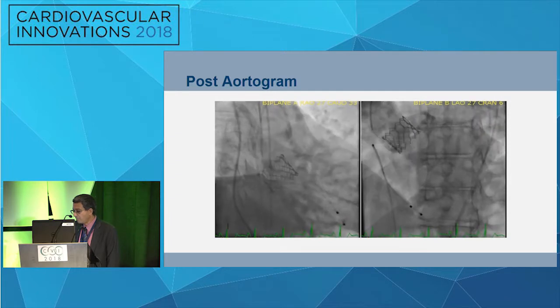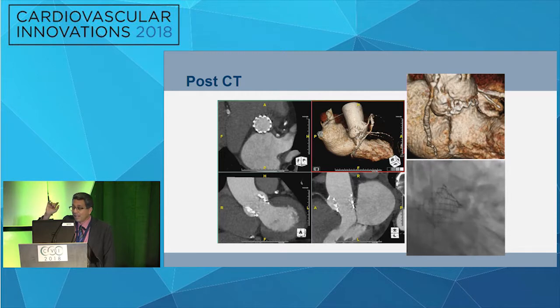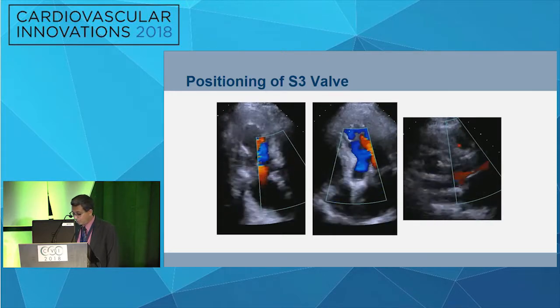If you bring the patient back to the CAT scan, you will see on the upper corner right there that the valve is just below the right coronary cusp, right at the non-coronary cusp. So it always sits like that. That's why I think that putting a valve in an RAO projection is a helpful technique to be very, very precise. For example, last year we did 500. We did not have a single embolization or anything like that. And our pacemaker rate is less than 5% with the S3 valve. We had four patients with AR, which was graded as 2+. This is the patient that I just showed you. This is the echocardiogram, and there is no aortic regurgitation.